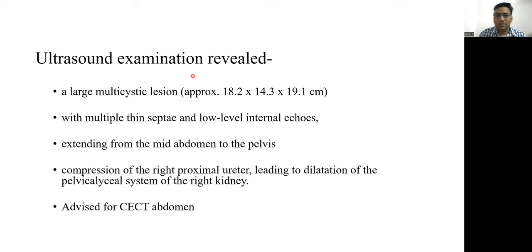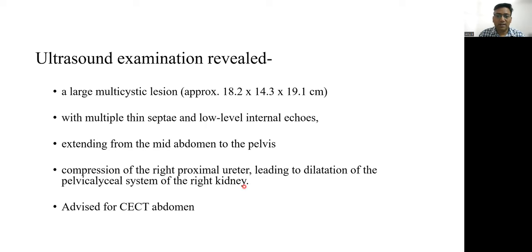The ultrasound examination revealed a large multicystic lesion with multiple thin septa and low-level internal echoes extending from the mid abdomen to the pelvis, causing mass effect on the right proximal ureter leading to dilatation of the pelvicalyceal system of the right kidney. We advised a contrast-enhanced CT abdomen for better depiction of this complex cystic lesion.